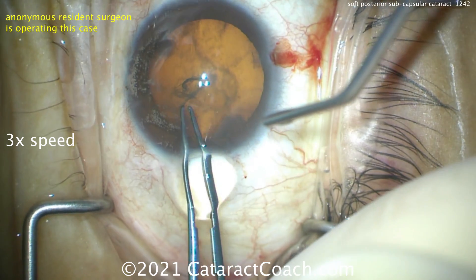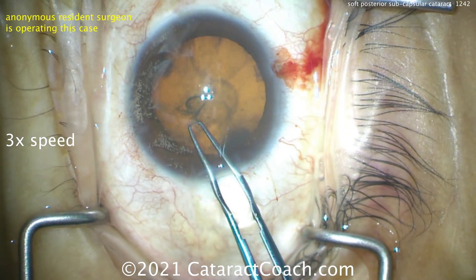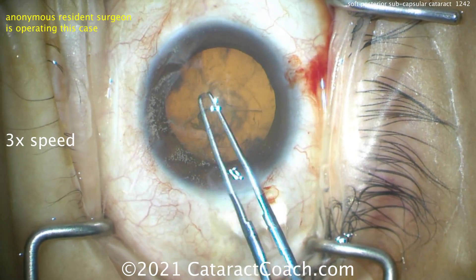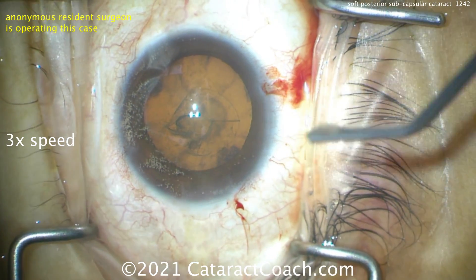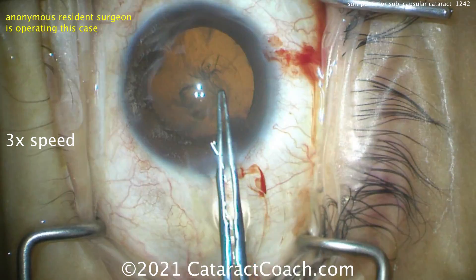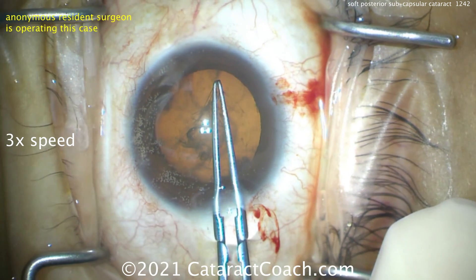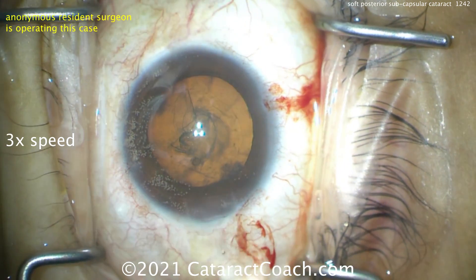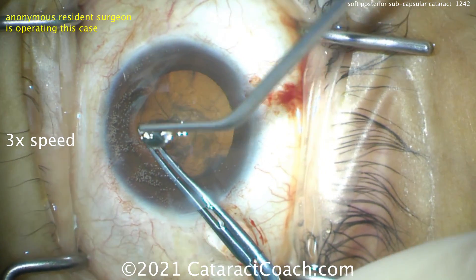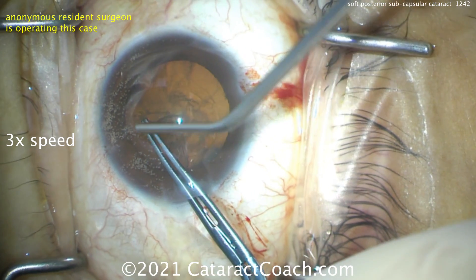This is in three times normal speed, so the total case was about 15 minutes in reality, and in the video it's only going to be about five. A little bit of help for the resident to get that rhexis started — explaining how to do things, now grabbing it there. Good, good pivoting — I like the pivoting. Want to really exaggerate that pivot, don't make a baby-size rhexis here. Good, now trying again and finishing that up, a little bit of instruction — last little grab, hopefully get this thing finished right up.